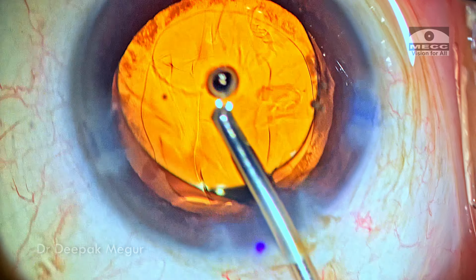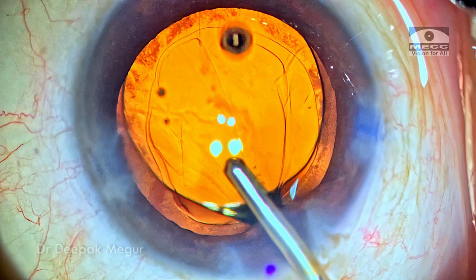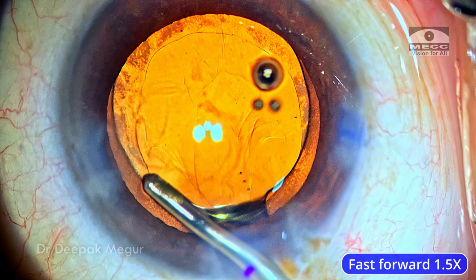So the eye is already filled with viscoelastic. I don't want to pressurize it again with the infusion. So I begin by using a very low bottle height. The bottle height comes to around 30 centimeters now.